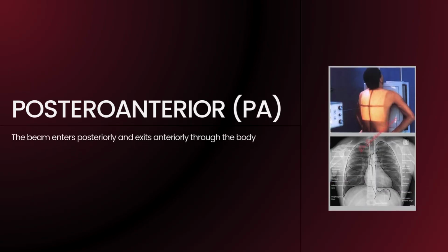Next, we move on to another terminology we call posteroanterior. For posteroanterior, from what we already discussed about anteroposterior, what do you think? It is this time around your beam is coming from the back of the body and is exiting the front of the body.